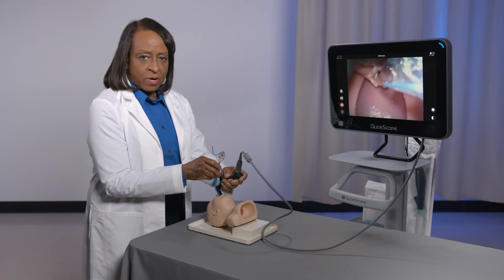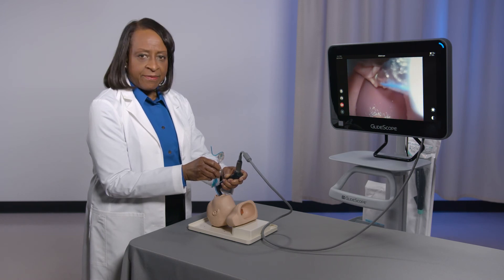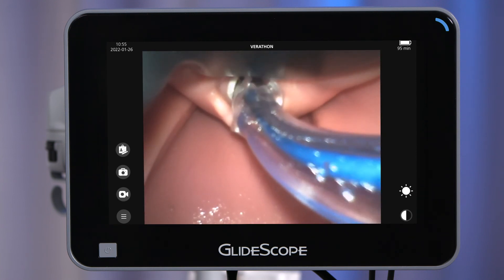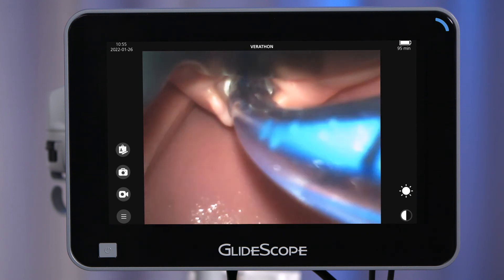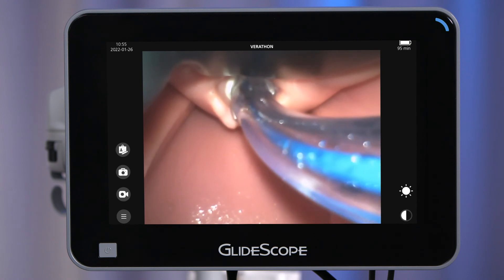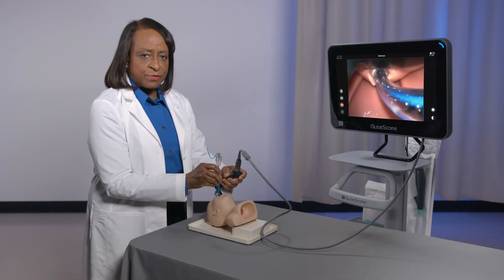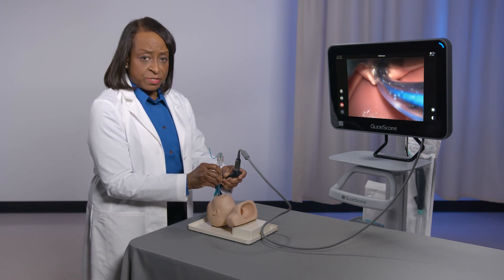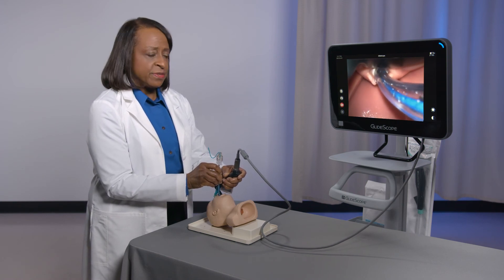In step four of the procedure, looking at the monitor, advance the endotracheal tube through the vocal cords under direct or indirect view. You may want to use both. If using a cuffed endotracheal tube, confirm the ideal depth and positioning of the endotracheal tube in the trachea.